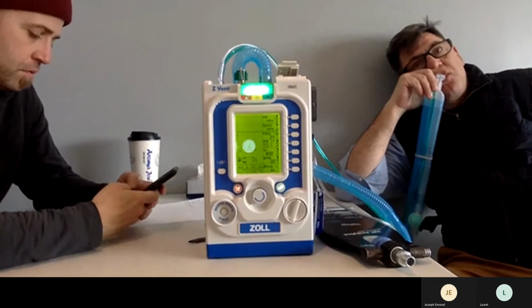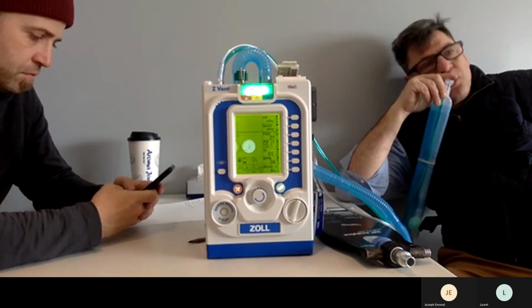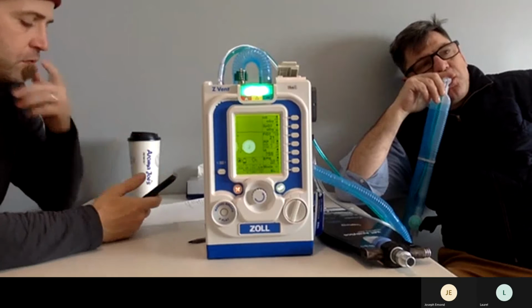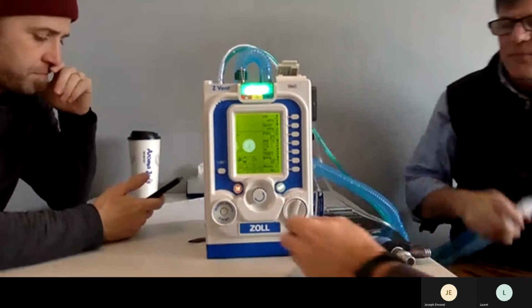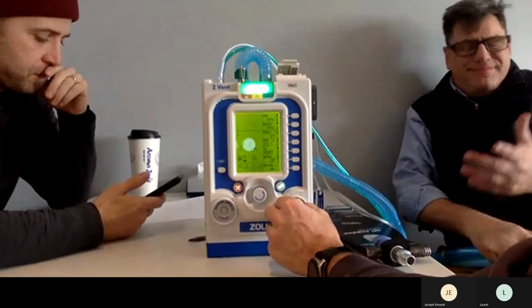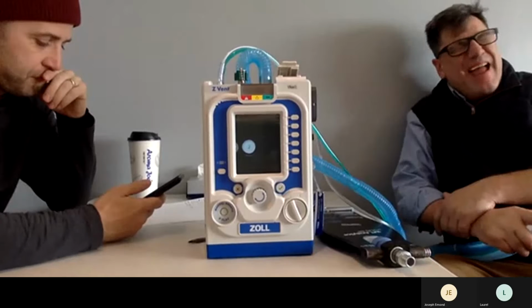And that's what our little masks don't do very well, these little CPAP in the bags. They're okay for 5 and 5, and that's it. A little more Venturi. Turn it off a little bit. Off a little bit or off? Typical guy. In my opinion, never mind.